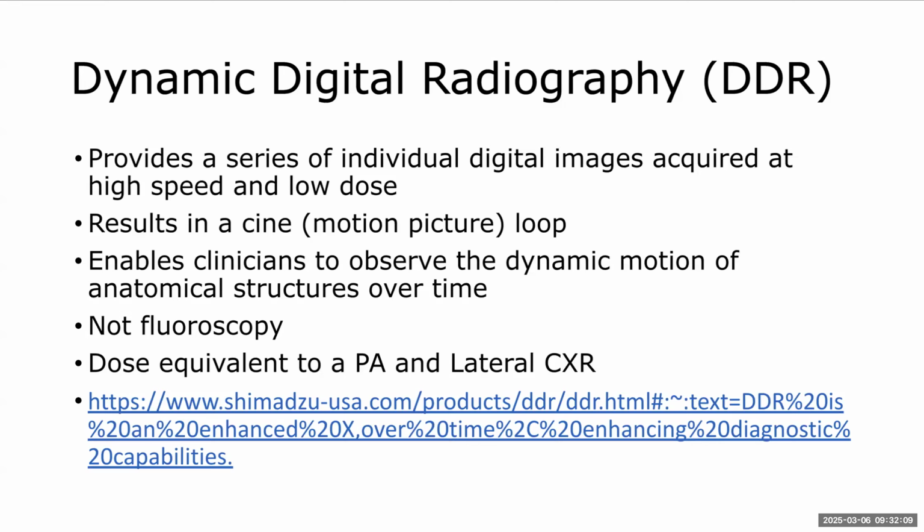about it. Shimadzu has this technology in some of their equipment, and it can be very useful, like I said, in pulmonology for things like sniff tests, also for things like lateral C-spines when they're maybe looking for whiplash and they want to do flexion and extension. So they can have the patient flexing and extending and do these images and then loop them together, and it'll look like a movie or a video.